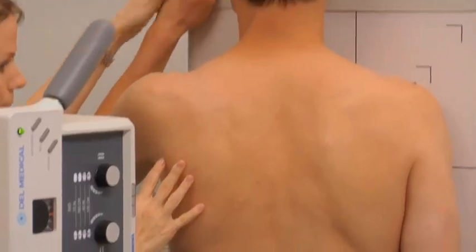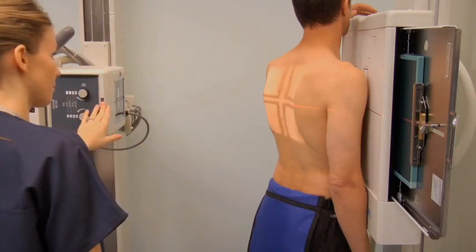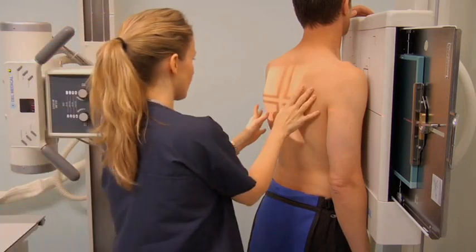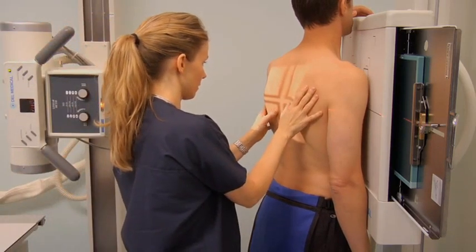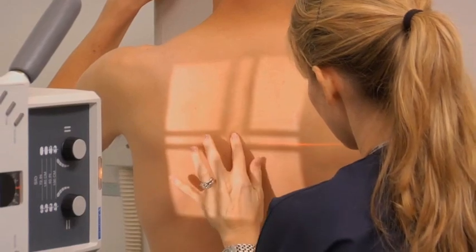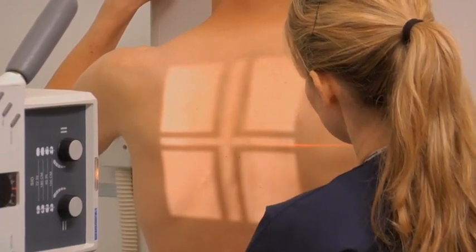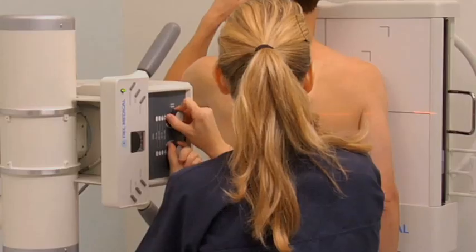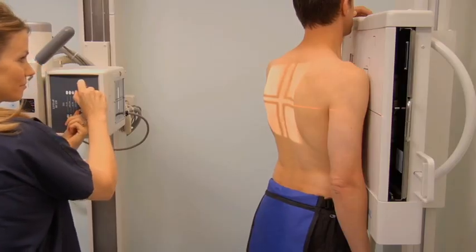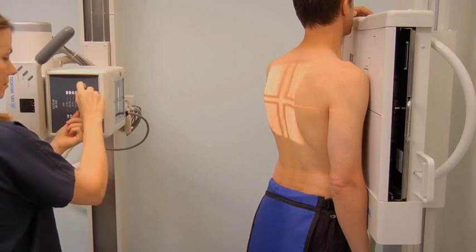With their right shoulder touching the IR, ask the patient to raise their left arm and rest it on top of the bucky. Align the central ray with the mid sternum at the level of the seventh thoracic vertebra, one inch to the left of the mid sagittal plane.